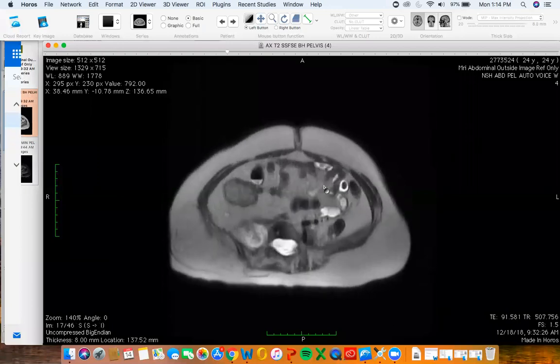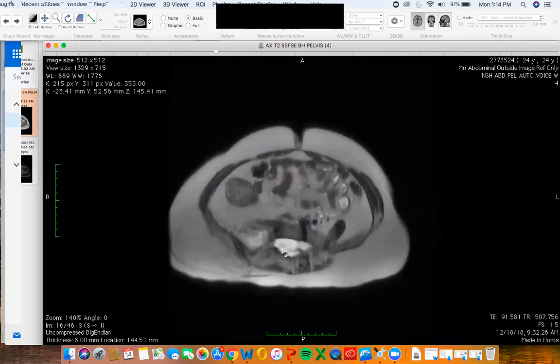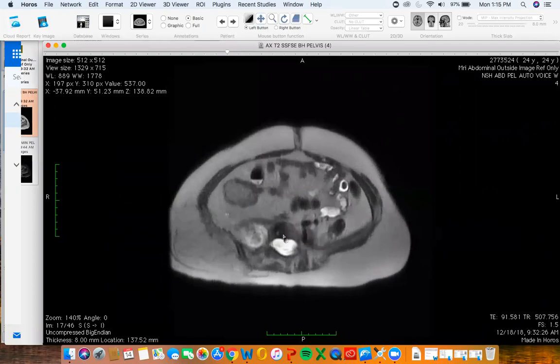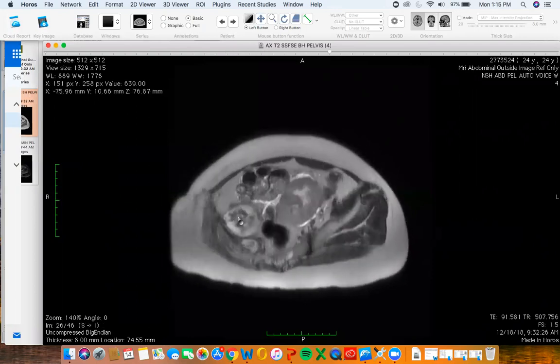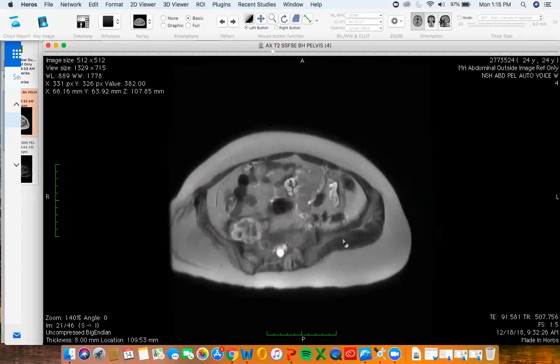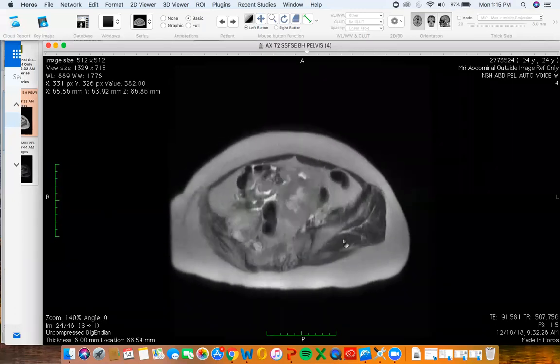So this is a young woman. You can see as we're going down into her pelvis, she's got this T2 hyperintense mass here that seems fairly affiliated with this neural foramen. It's kind of going in an elongated fashion over there. And then as we go down a little bit further, she's got another one. So any thoughts about what those could be? They're pretty bright. They're like kind of going along the nerve roots.